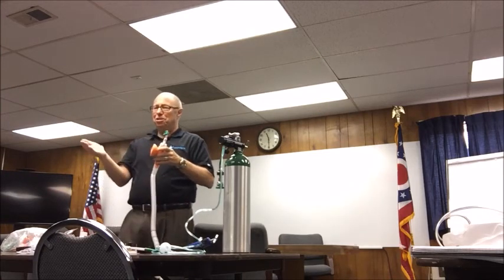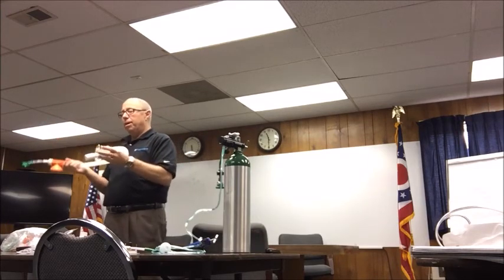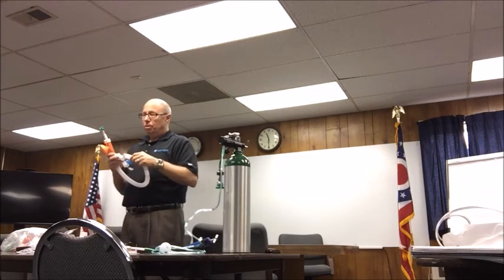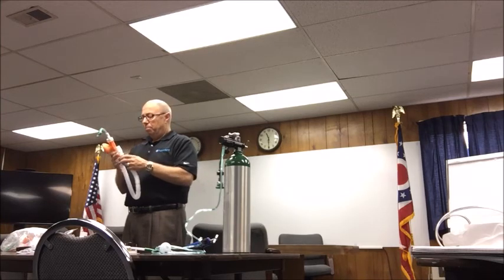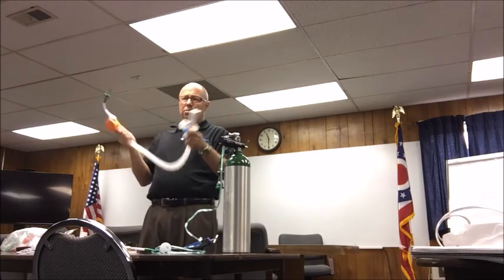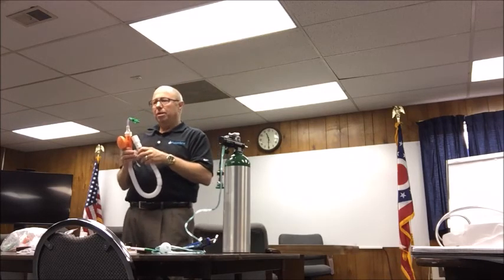As much as I'd like to say this cures everybody, we're gonna have to intubate patients. I don't know if y'all are RSI or what, but we're gonna have to knock them down and intubate some patients. Obviously, this has reduced our intubation rates by 60-70%, but there are those patients that are sick enough, or wait too long, that we're gonna have to do that. I can get Emily that documentation from Bledsoe, but I think you'll be really surprised by using this at 30%. There might be a patient or two that you might go to 60. I don't know any patient that needs 90%. If they need 90%, they need to be intubated.